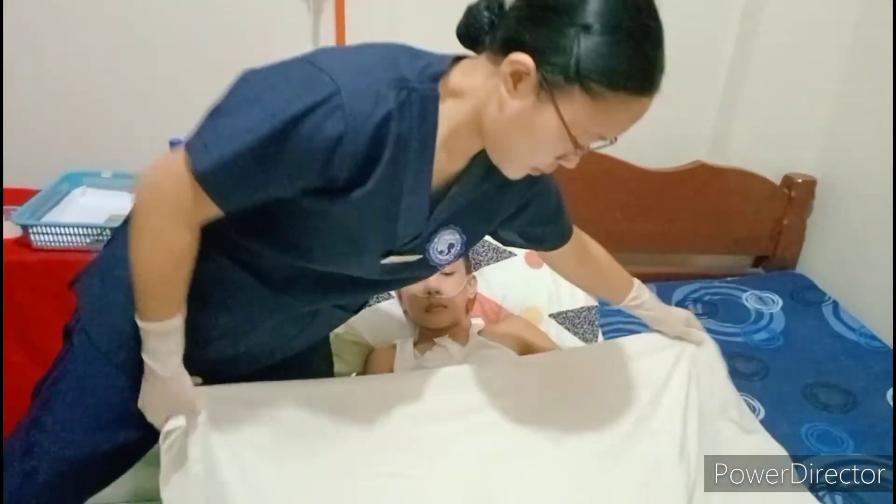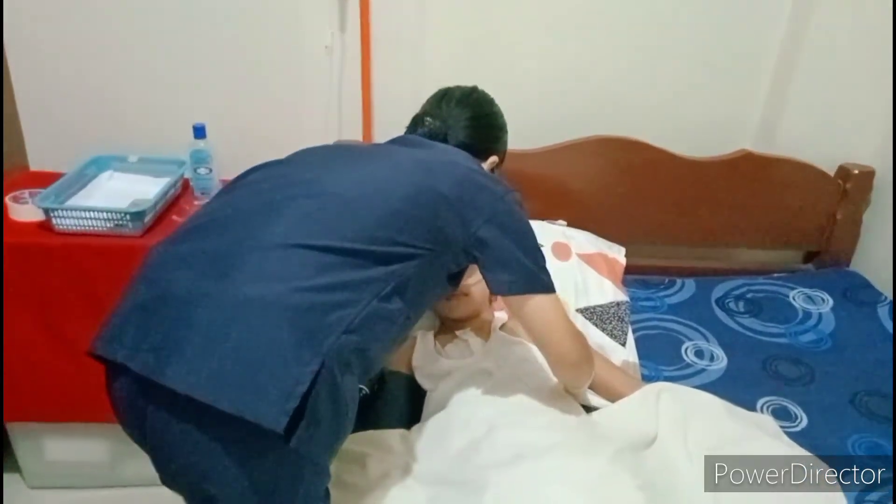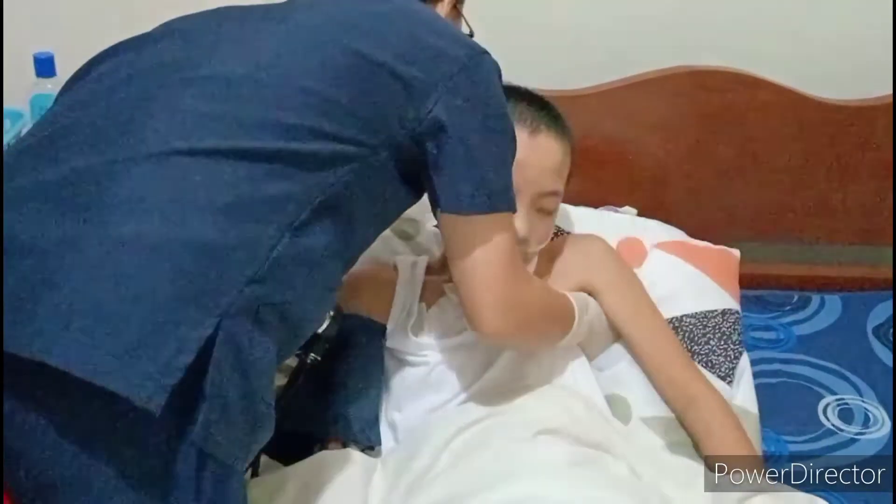Place the patient in a comfortable position, then remove gloves. Evaluate the central venous pressure reading and compare it to the baseline. Report any significant findings and clinical changes to the physician. Finally, document the central venous pressure reading on the flow sheet, noting the condition of the catheter insertion site and any complications or actions taken.